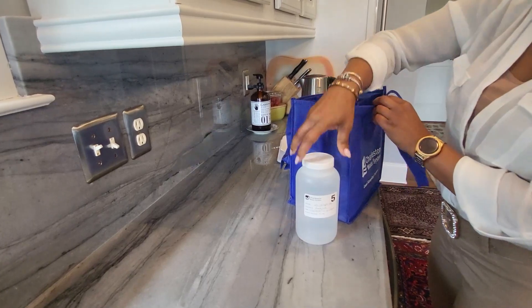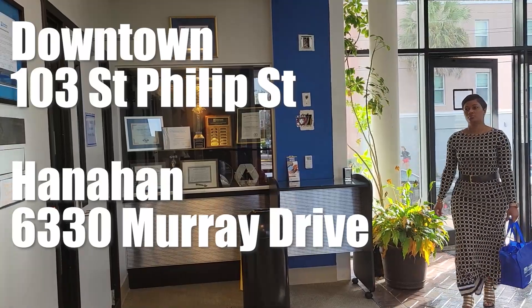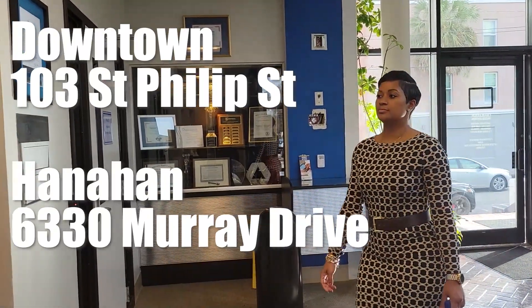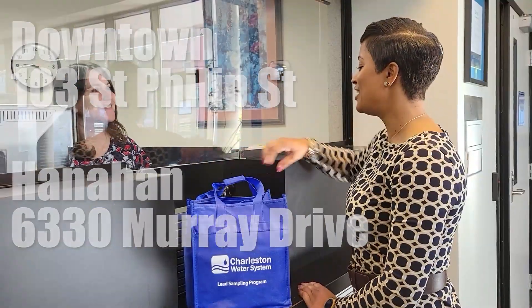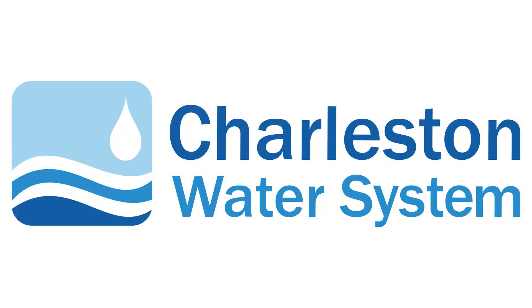Place the bottles and the completed paperwork in the sampling bag and return to either our downtown or Hanahan Charleston Water System office. Thank you so much for taking the time to watch this video. Your participation not only helps keep your family safe, but all of Charleston Water System customers. Take care, Charleston!